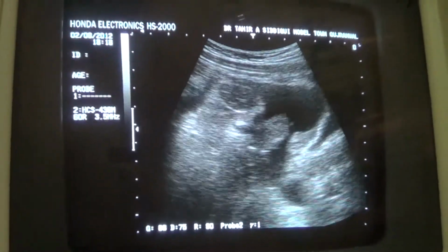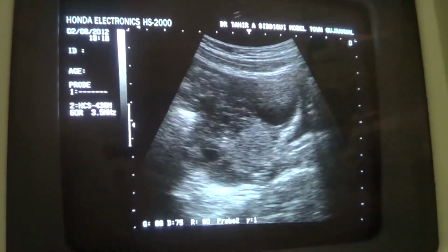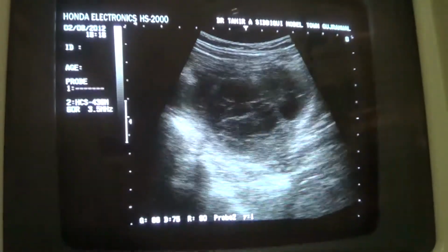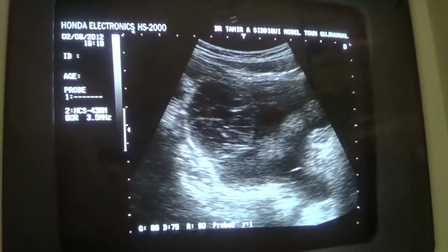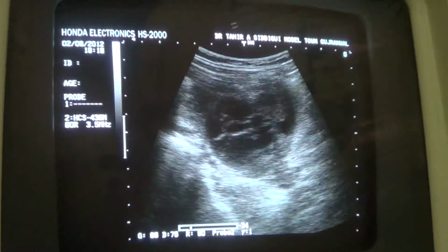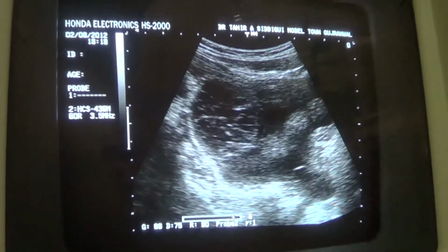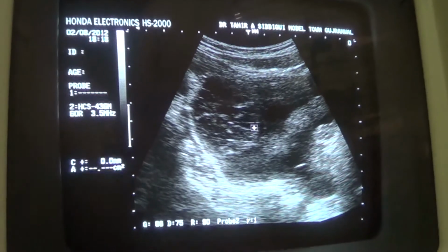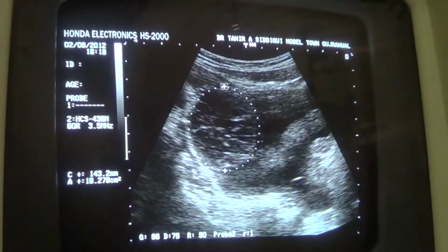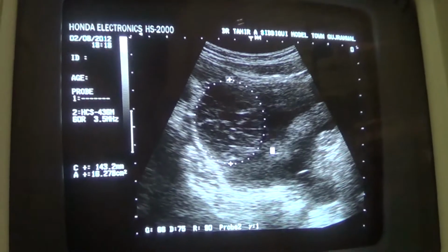So in conclusion, what I will conclude is that this is a case of tuberculous bowel disease with this tubo-ovarian mass also representing a tubo-ovarian cystic complicated mass of infective nature. Rest, this is the fluid. This is the fluid.